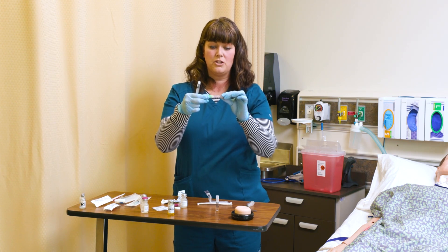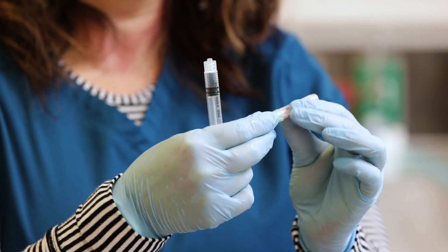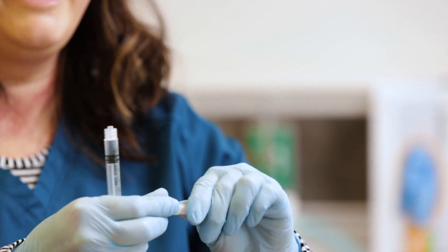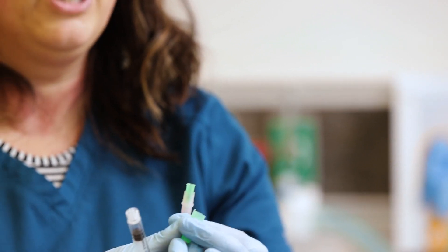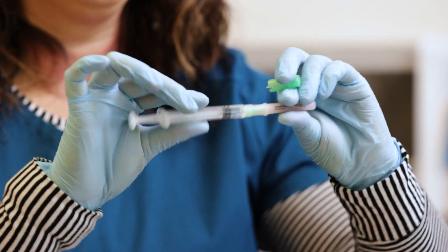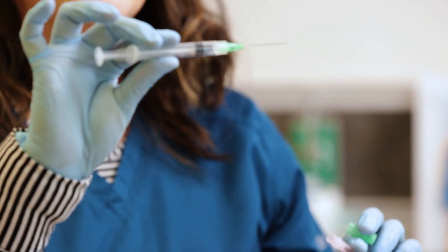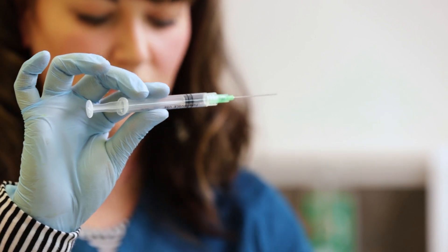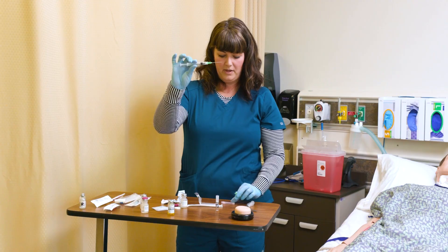These look different depending on the manufacturer or facility you use, but it will say 'filter' on it. Do not inject a person with a filter needle — the solution will just squirt right back out. Luer-lock that into place. It's a pretty big needle.